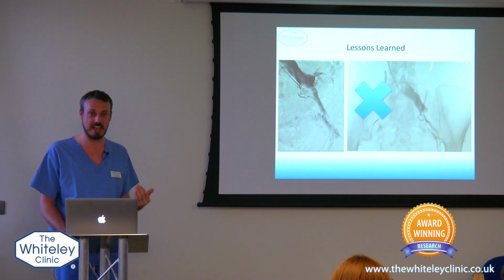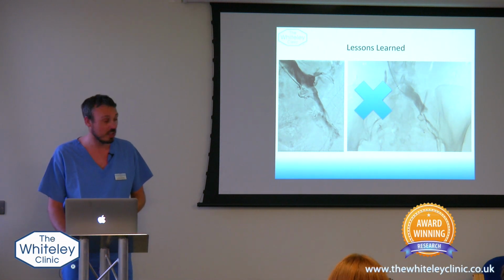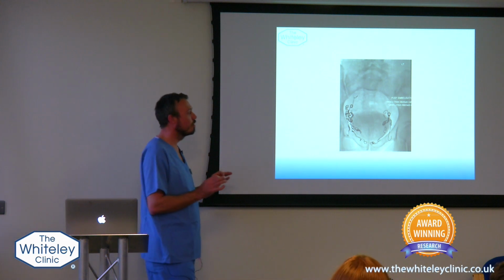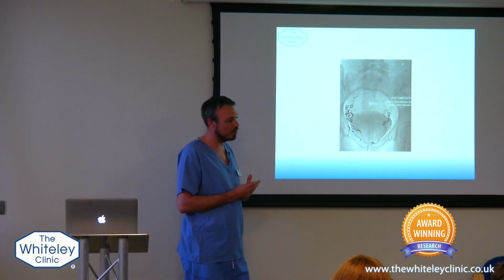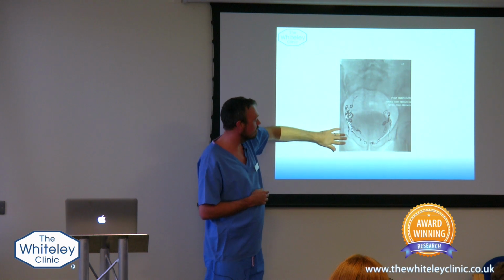So that gets a big cross. That's not how you do pelvic vein embolization at all. That's how you do pelvic vein embolization. So now you've got smaller coils, but the coils themselves are much deeper into the veins. And actually the regions that we're looking at are twofold. There's an obturator vein that comes down the side.